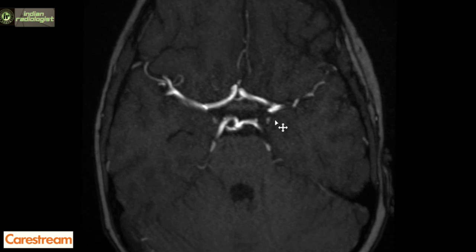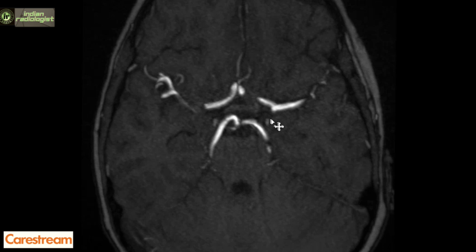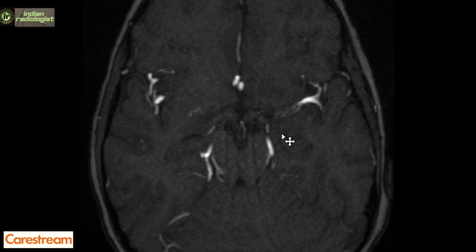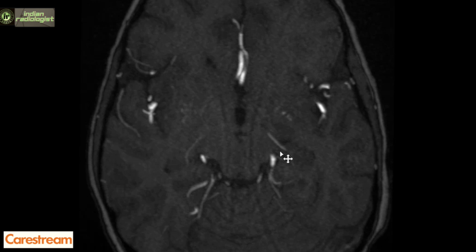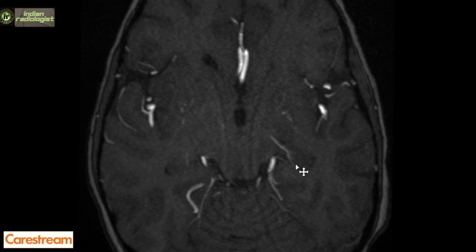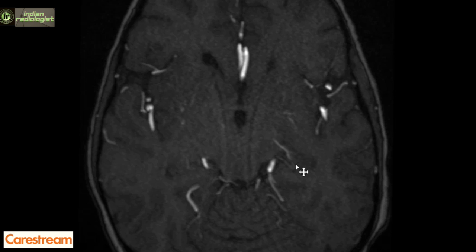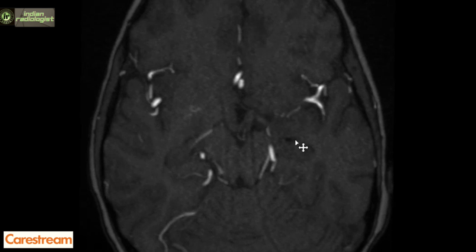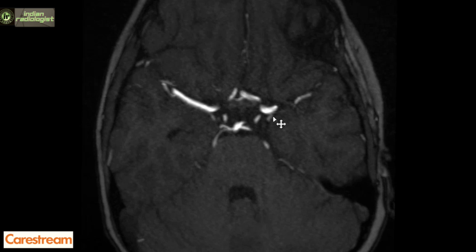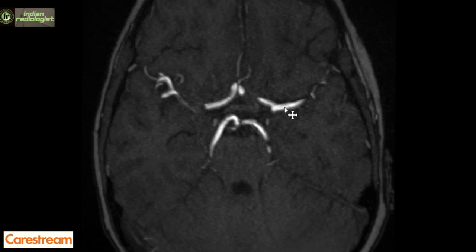The anterior choroidal artery arises from the ICA posteriorly, lateral to the optic chiasm and distal to the PCOM. It has a cisternal segment which passes between the optic tract and uncus. It then passes across the medial wing of the ambient cistern to enter the choroidal fissure where it becomes the plexal segment. It runs within the choroid plexus of the temporal horns and continues around the trigone of the lateral ventricle into the choroid plexus of the posterior horn and body, sometimes as far anteriorly as the foramen of Monro. After giving rise to the anterior choroidal artery, the ICA terminates by dividing into the anterior and middle cerebral arteries.